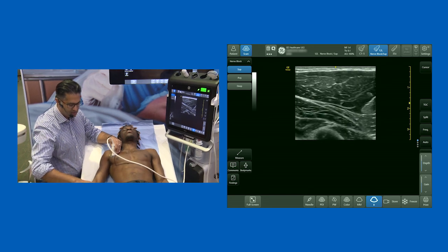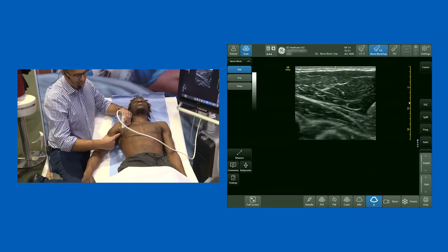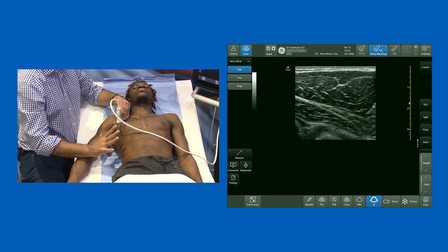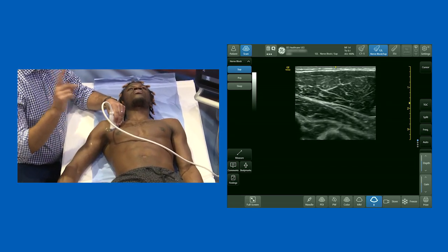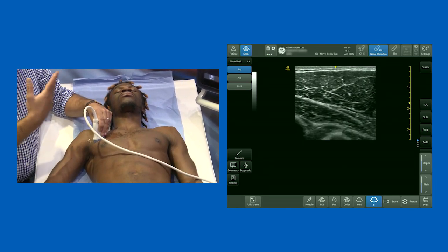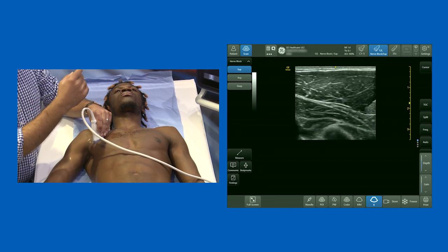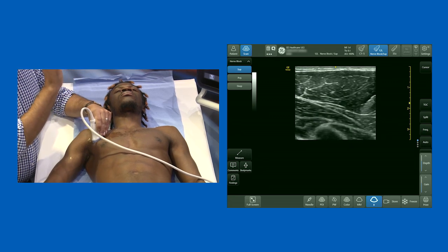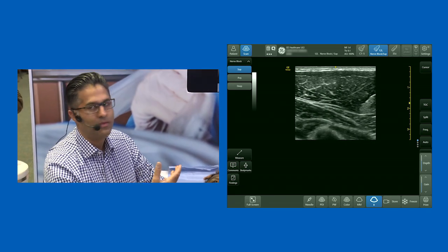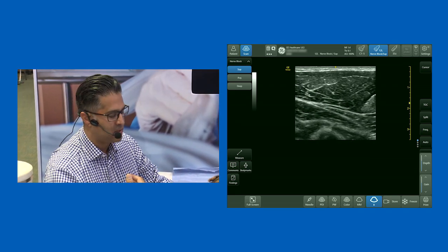If you gently move the arm out to the side, it stands to reason that if you're injecting local anesthetic down here, you're going to catch that lateral innervation. The vast majority of patients don't look quite as beautiful as this — this is a great machine showing off his anatomy at its best. So if I really wanted to get reliable lateral chest wall innervation, that's when I'd move around to a serratus plane block.